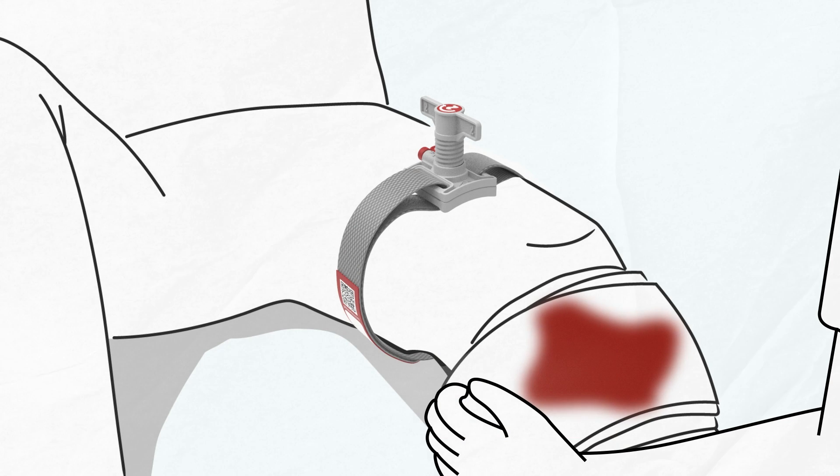If possible, the tourniquet should be placed directly over skin. If it is placed over clothing, ensure there are no solid objects like a wallet or phone. Do not place the tourniquet over a joint. When in doubt, place it as high and tight on the injured limb as possible.